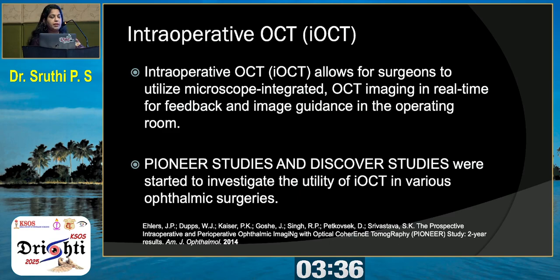Coming to the next, intraoperative OCT, that is IOCT.